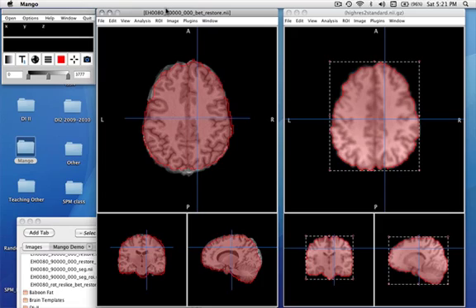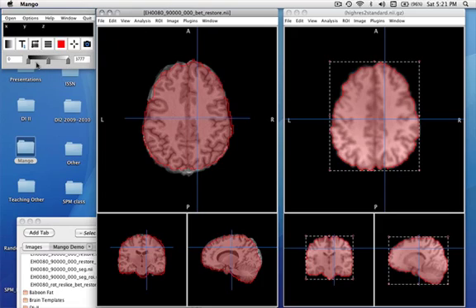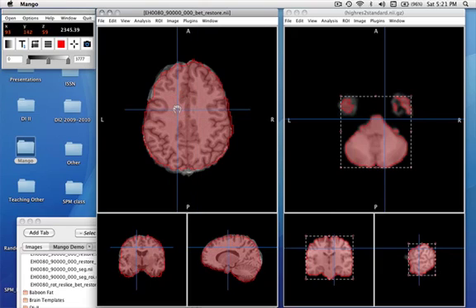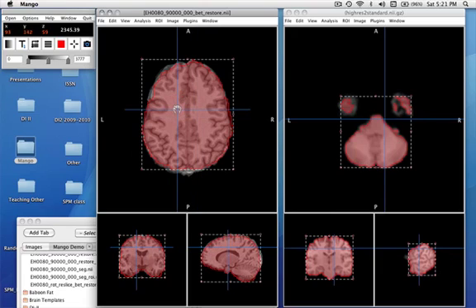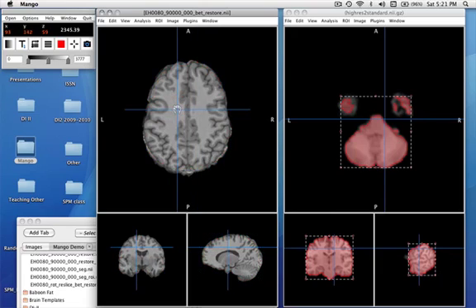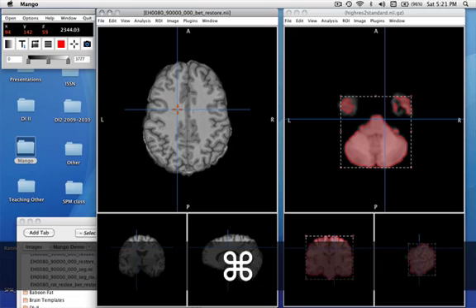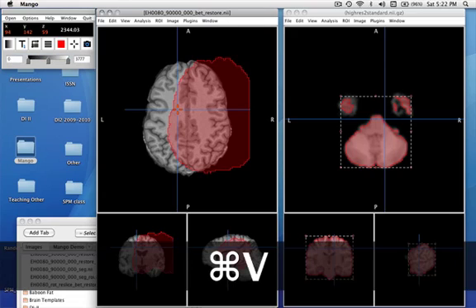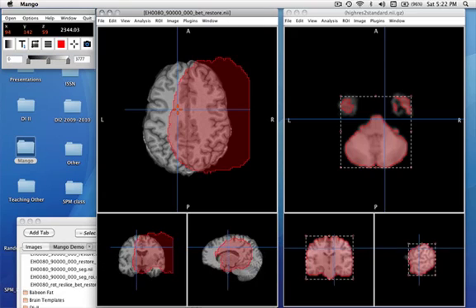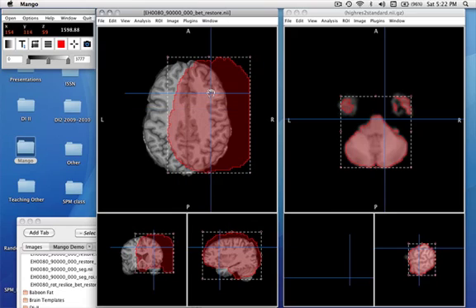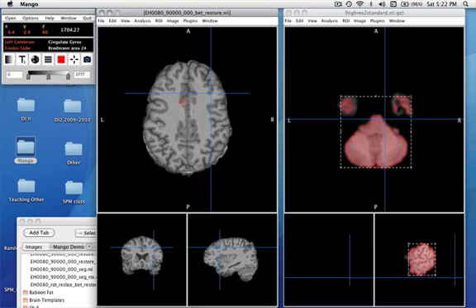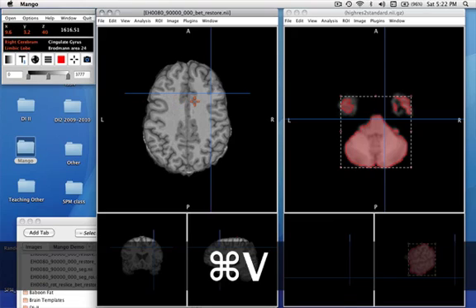If I had not picked the world coordinate system, this overlay would not work well. For instance, let's paste it in again. So if I paste it in and it's in a different mode, it aligns now back to the image space. So let's repeat that into the world coordinate space.